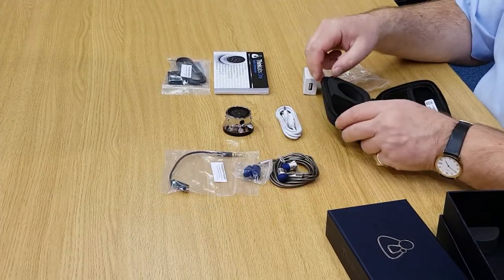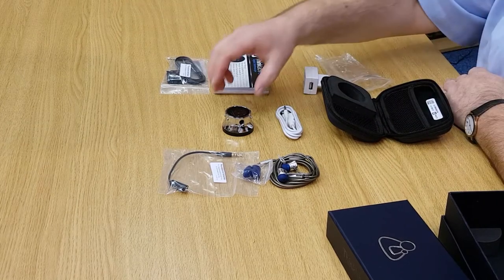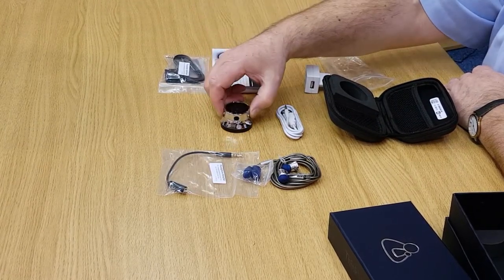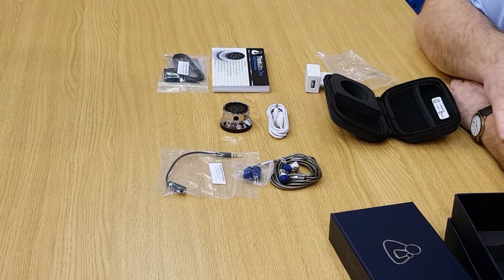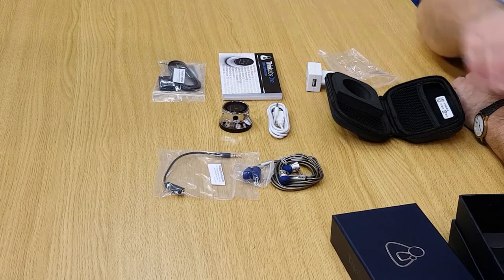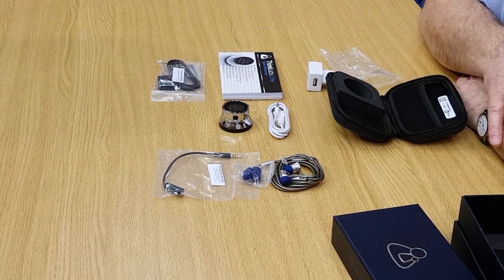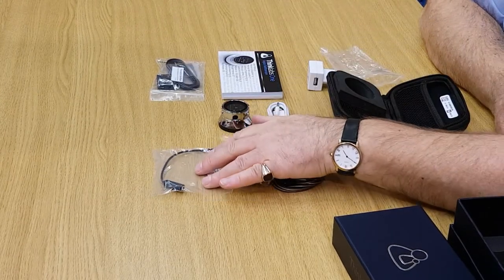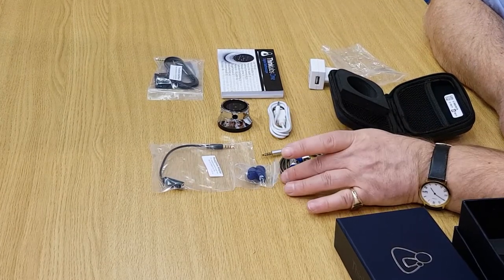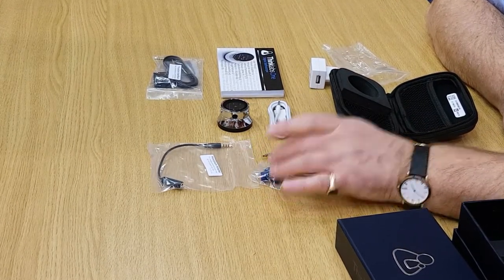So that's what you have inside your Think Labs One digital stethoscope: the actual product with the diaphragm on the bottom, USB charge lead, a set of instructions, a switch unit for connecting between headphones and laptop, a feed cable so that you can go into your mobile phone, a set of earphones, and replaceable tips.